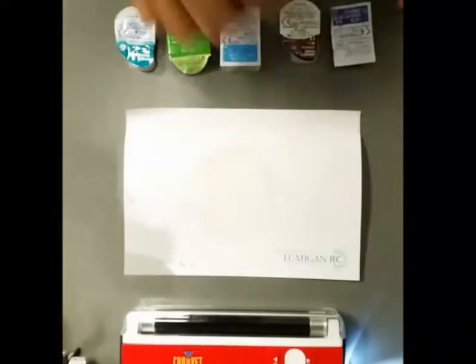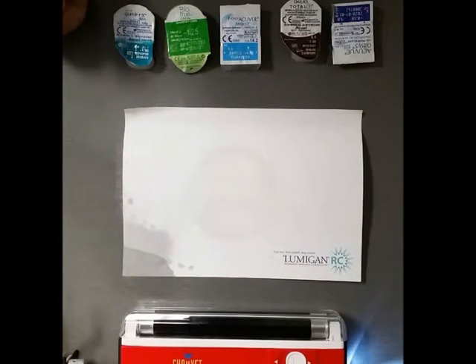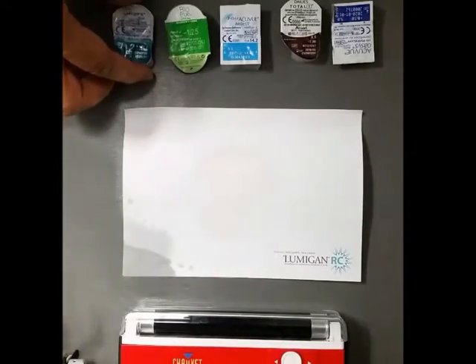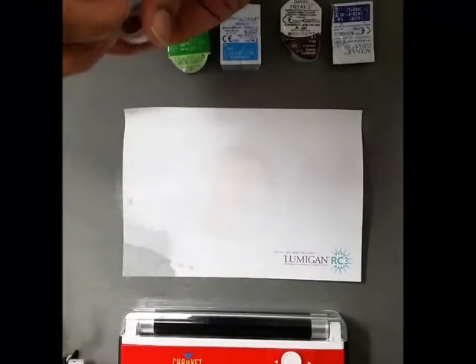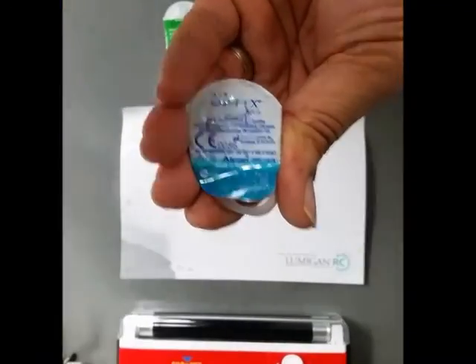I'm going to get these contact lenses now on the same piece of paper. The purpose of this experiment is to see which contact lenses block UV exposure. You're putting these contacts on your eyes, so let's see which ones work. We have here your optics.